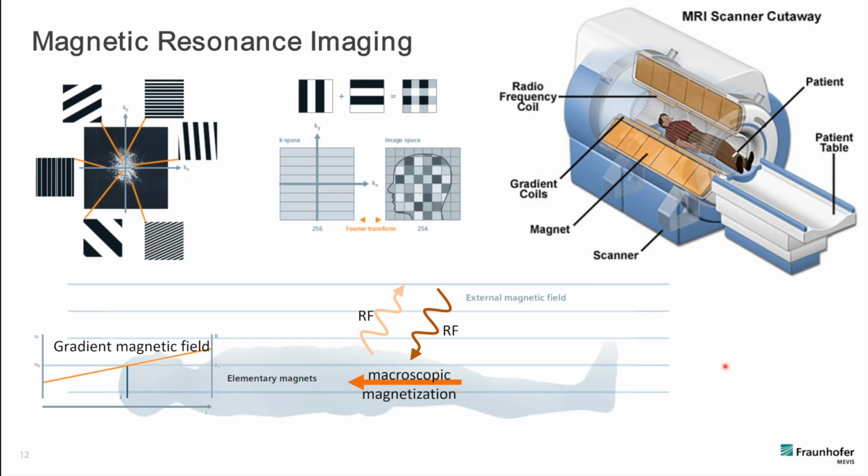That's just the typical way. For metamaterials, we are dealing with a transmit and with a receive field. We can modify the transmit RF, the receive RF, and we can get spatial encoding using spatially encoding metamaterials. I will also show you a few examples of this later on, so you can get spatial information from this as well.